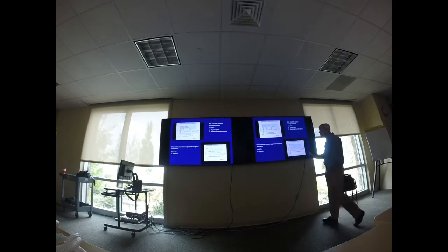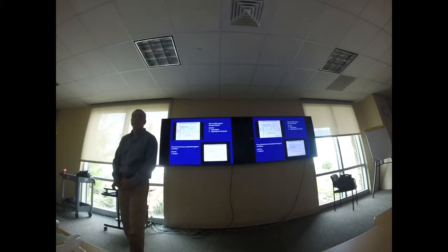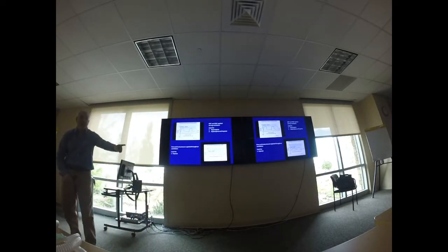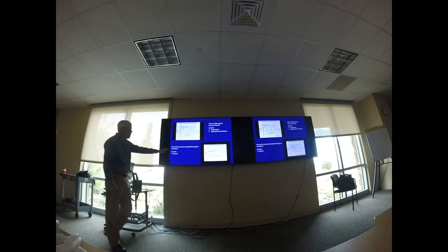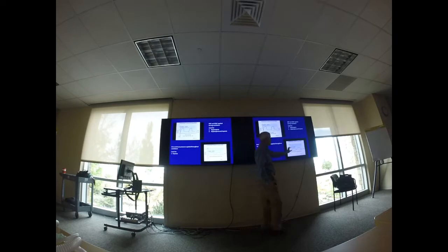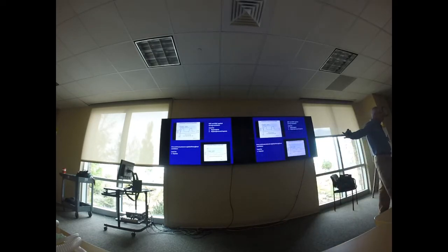So again, I just wanted to show you guys the graphic representations beside each other so you could appreciate the fact that CPAP is continuous positive airway pressure. It doesn't change. This is normal ventilation. This patient is normally breathing right here, and the pressure is just applied throughout ventilation for the purpose of opening up the alveoli, recruitment, and decreasing preload.